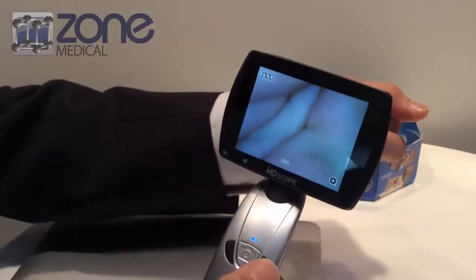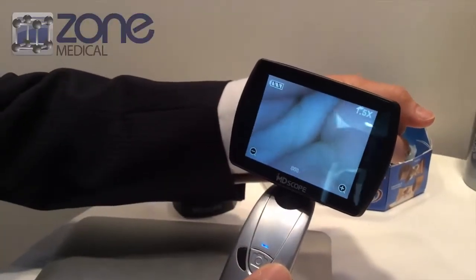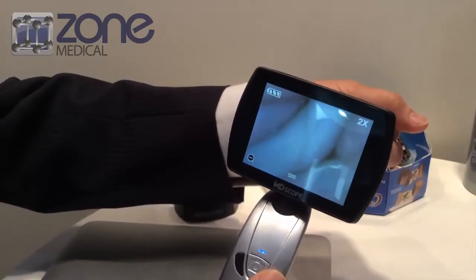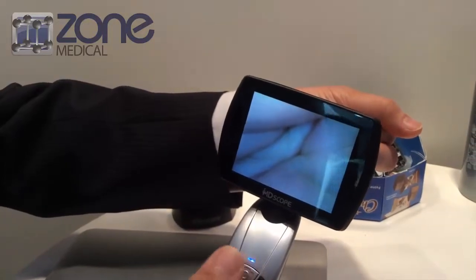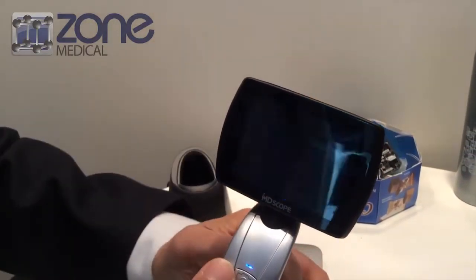You can enlarge it by pushing the button — that's a digital zoom. Take a photo and you can preview it.